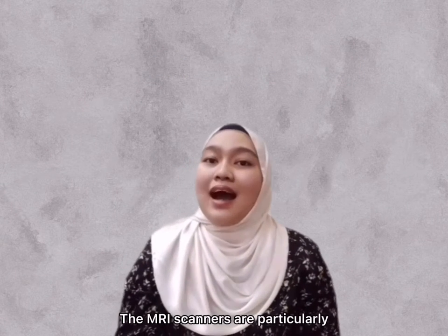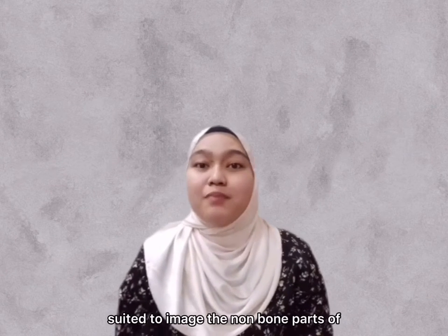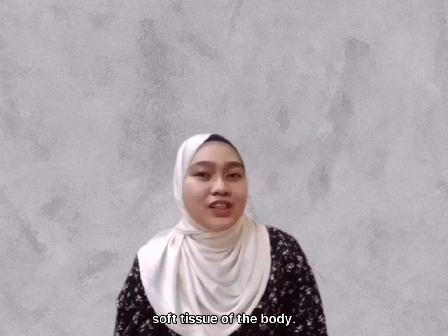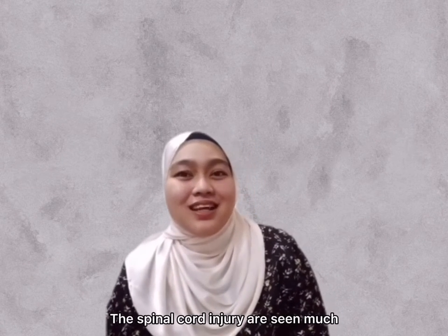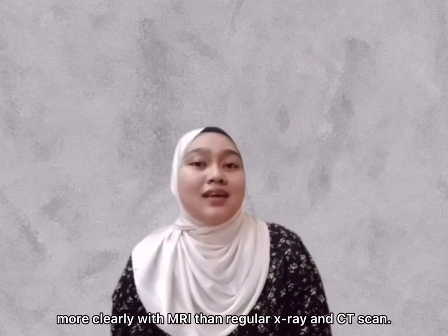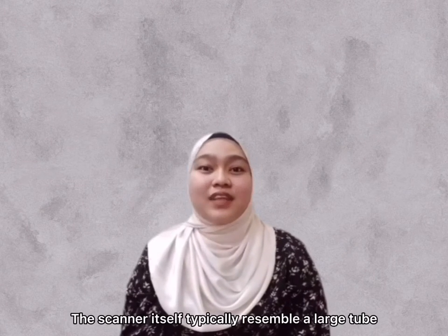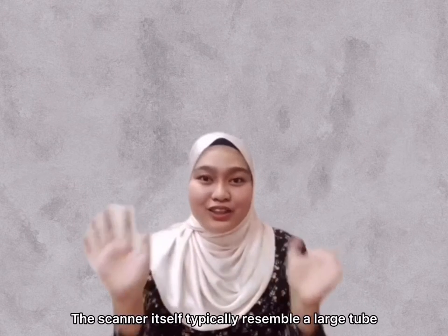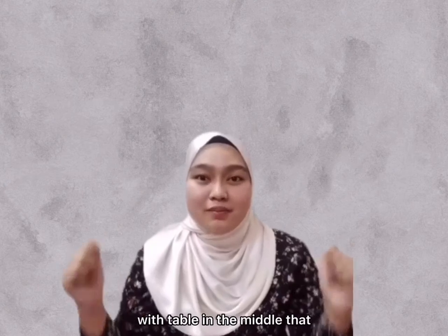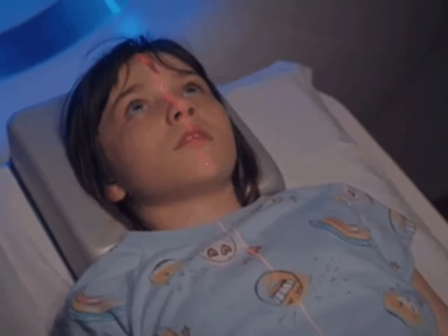MRI scanners are particularly suited to image the non-bone parts or soft tissue of the body. Spinal cord injuries are seen much more clearly with MRI than with regular X-ray and CT scan. The scanner itself typically resembles a large tube with a table in the middle that allows the patient to slide in.